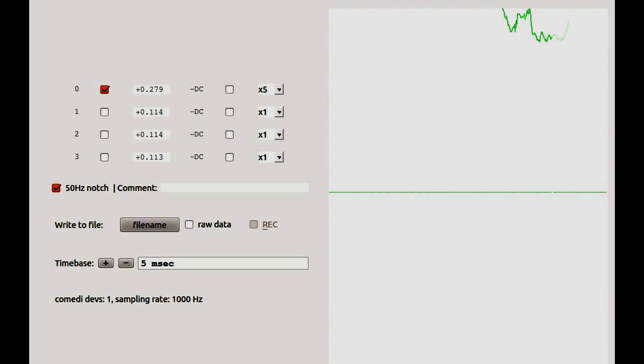Right. So we're constantly bombarded with electrical signals in our environment. And our differential amplifier, it's got the positive and negative, and it's finding the difference between the two to remove these signals. But when you're moving, and you're moving the electrode leads, it can't effectively do this. So we're getting movement, and then we're getting it in our signal as well.